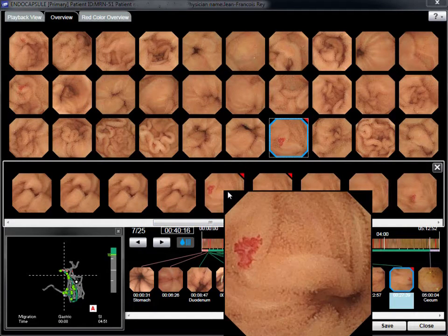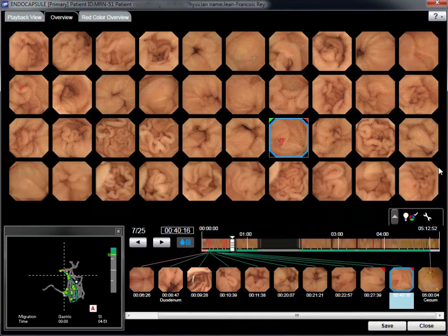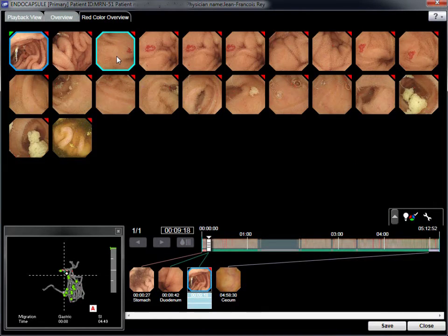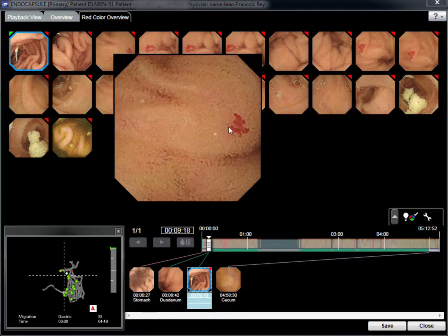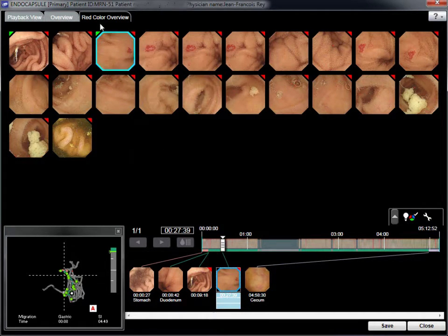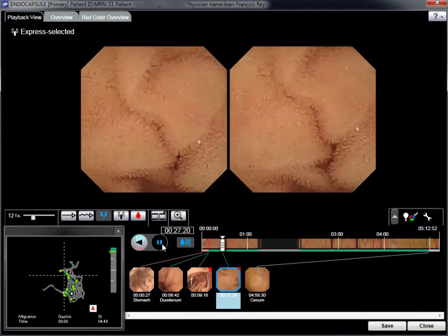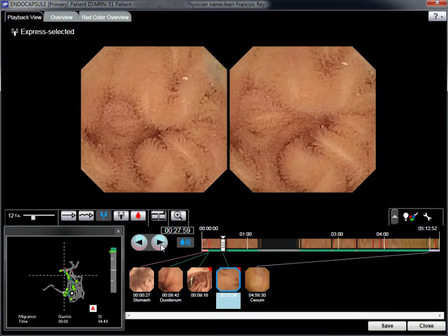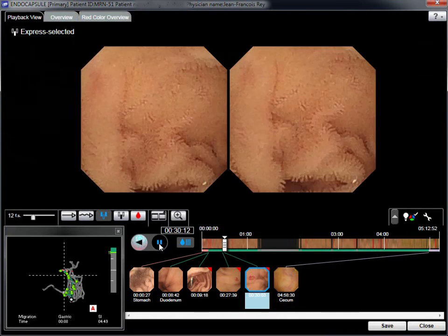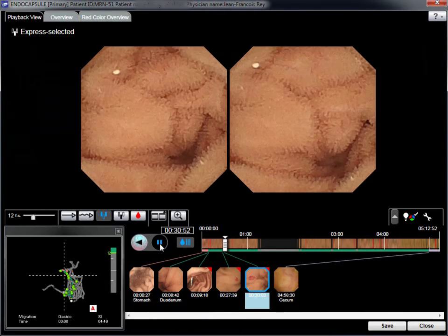Enhanced pictures or sequences are important in order to identify multiple angiomas. As the capsule is sometimes stationary, the same angioma can be recorded for minutes from various aspects. The real diagnosis starts with a review of all capsule images in express-selected mode, during which other angiomas are identified and their images stored with the other thumbnails.